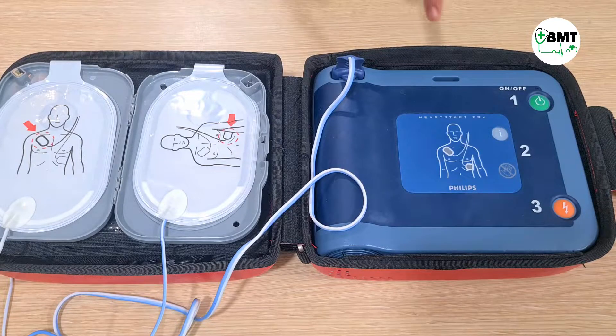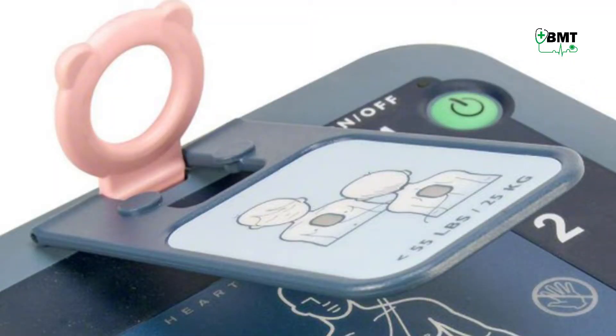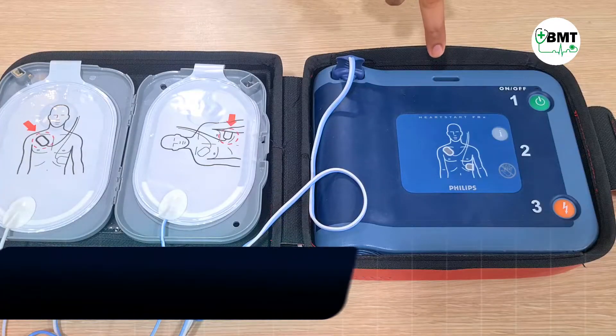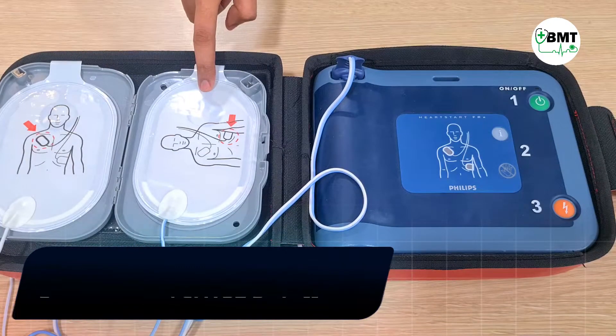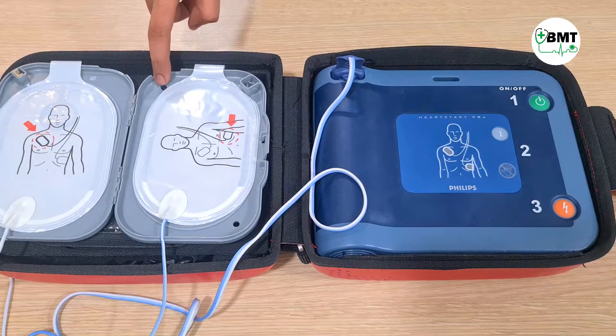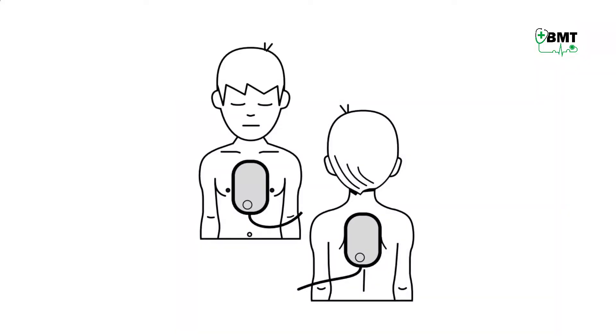In infant or child mode, you have to insert the key here. After inserting this key, the instructions will automatically start in infant or child mode. The only difference in infant or child mode is the placement of the pads — one pad is placed in the front and the other is placed in the back of the child, as shown in the image.